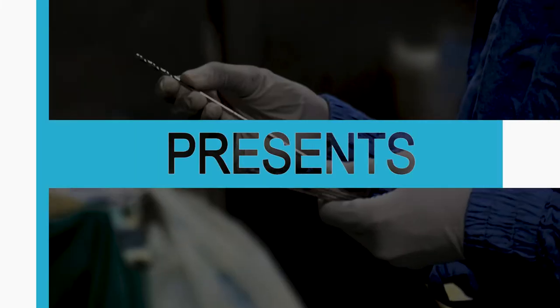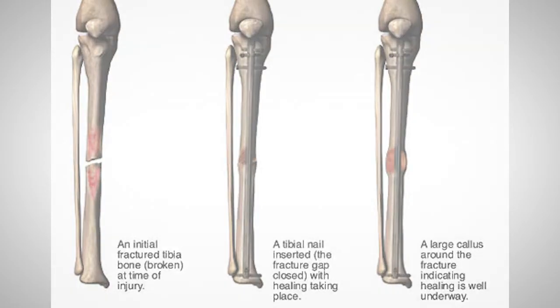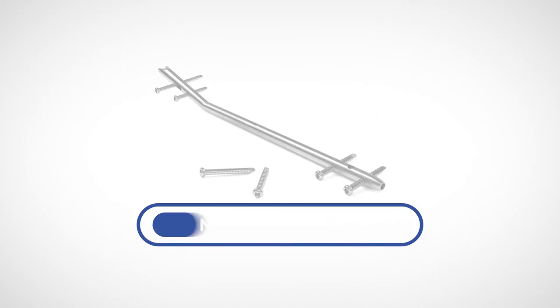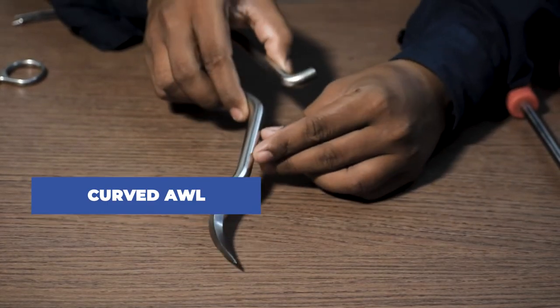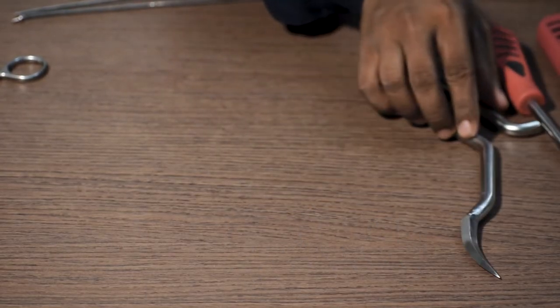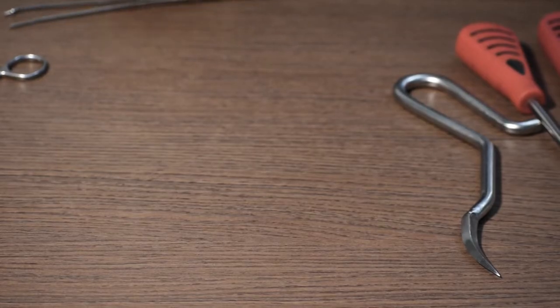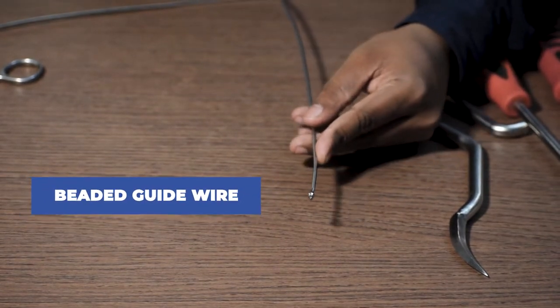Tibia nailing is used to fix shaft fracture of tibia as shown in the diagram. This device is called a curved awl. This is used to make the entry point for the tibia nail. This is a beaded guide wire.